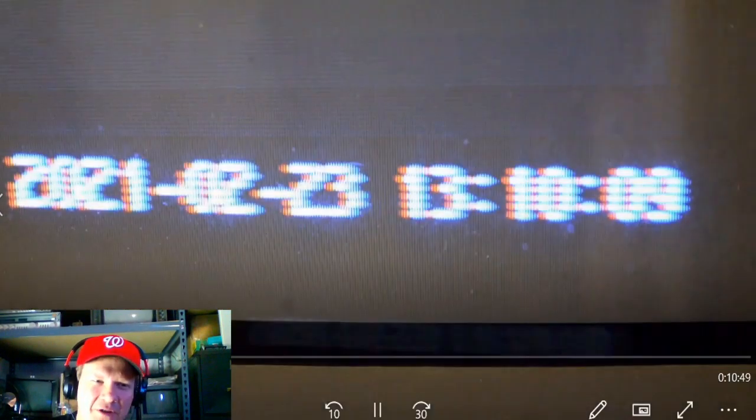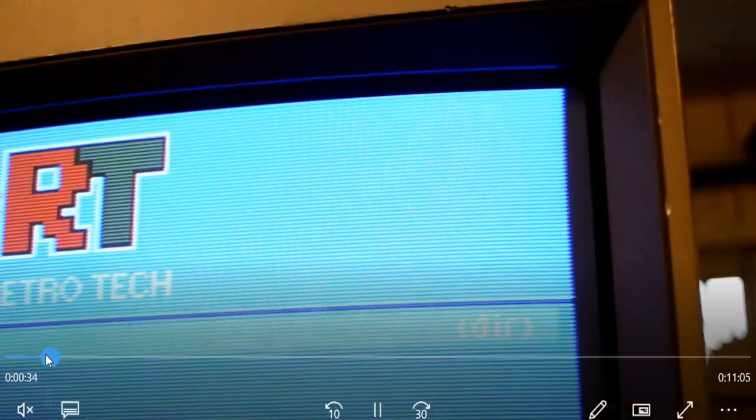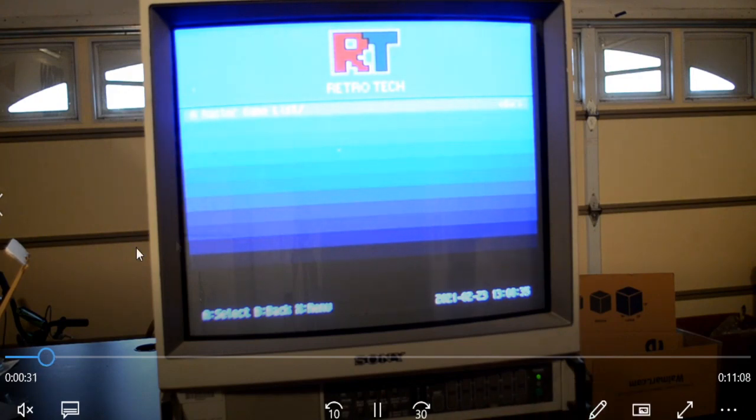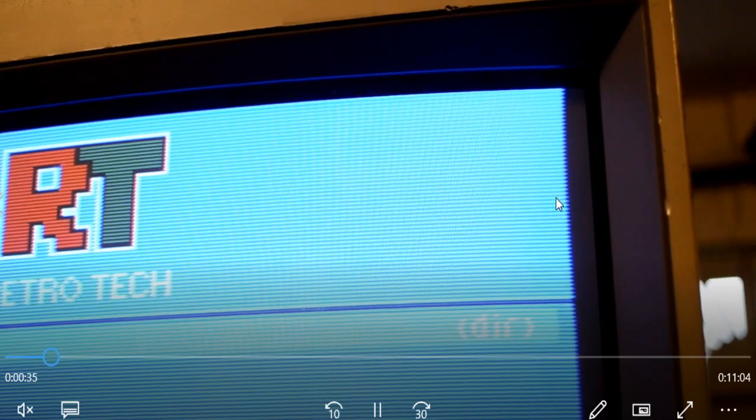But anyway, I want to show you some pictures before of this monitor and the condition it's in currently. So I'm going to drop myself out of the picture here for just a second and show you some before action shots. So this was one of the major problems on this monitor. Let me back up just a second and show you what it is. First, we've got a pretty good issue here on this right-hand side with our geometry. And that's just a big black line down the side and a couple of wonky spots on that side.